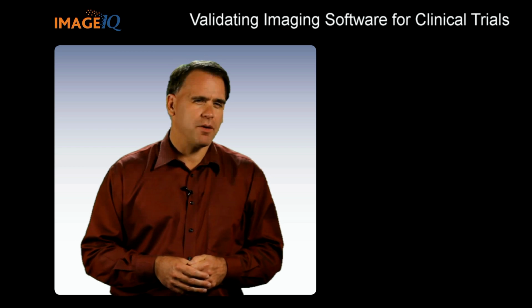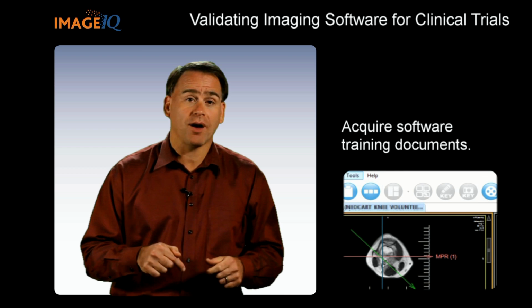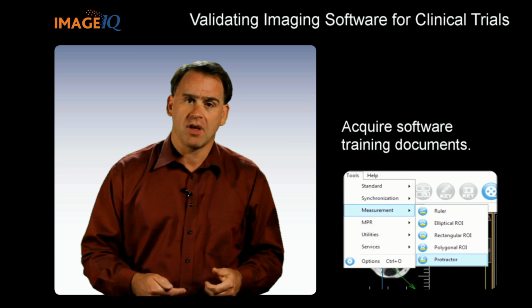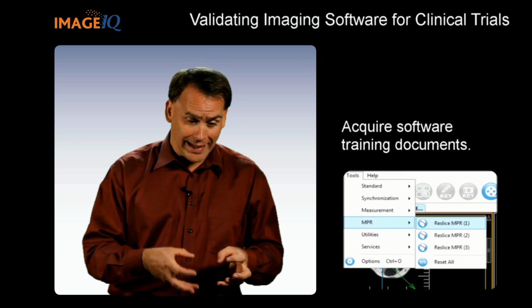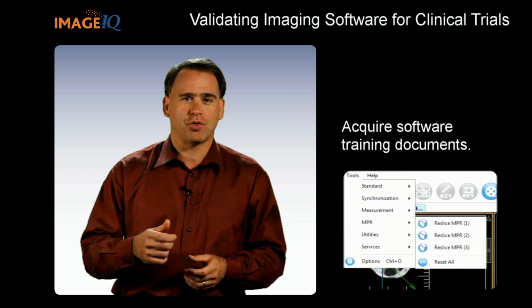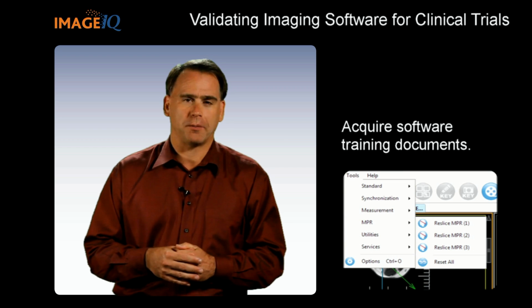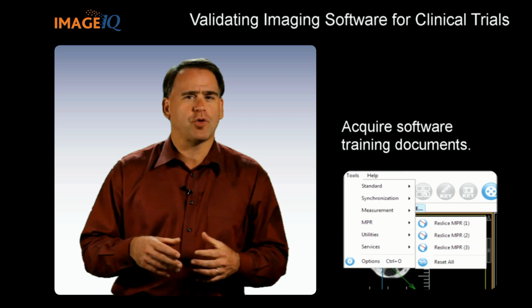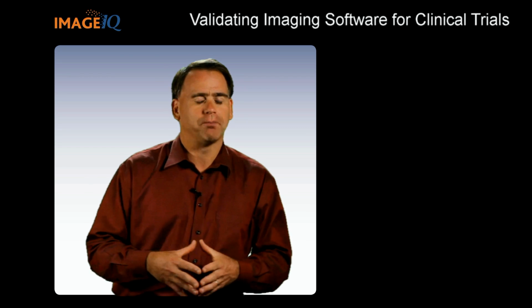Also, it's considered a best practice to have the training records and credentials of your radiology team that reflect their expertise in using the software for the anatomy or pathology of your study. This is especially important if they're using one of those non-standard techniques we talked about. Certainly, everyone trusts their imaging core lab, but you want to make sure you've closed that training record loop.